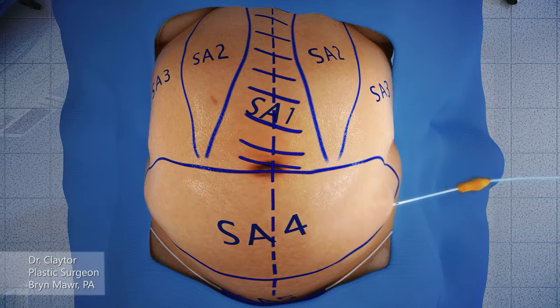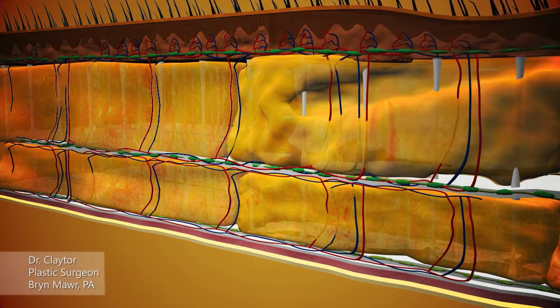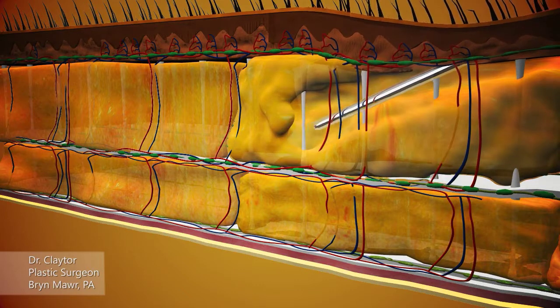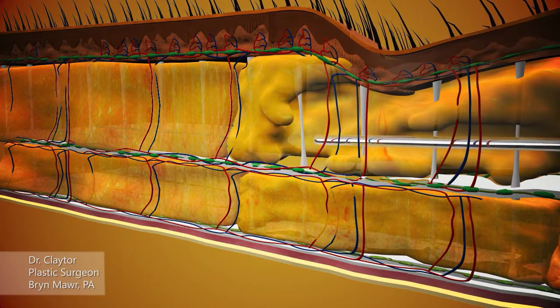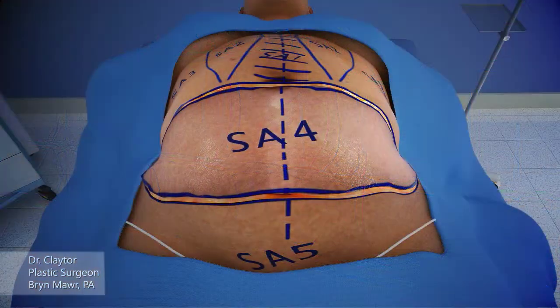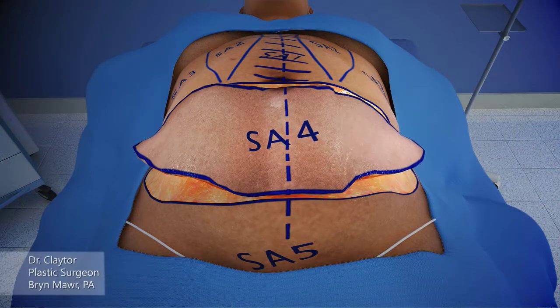Here the markings for the area to be suctioned are marked out, and liposuctioning is being done in suction area 4, which is going to be completely removed. The liposuction cannula is demonstrating removing the fat from the subcutaneous layer; the middle layer is the Scarpa's fascia. The suction area 4 abdominal flap is removed completely.